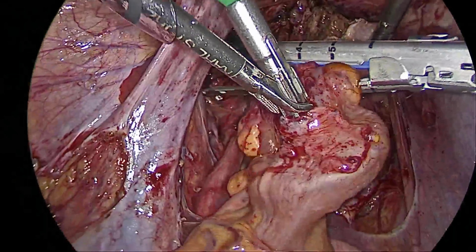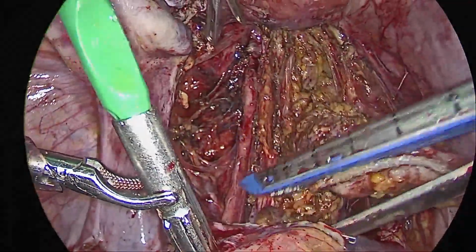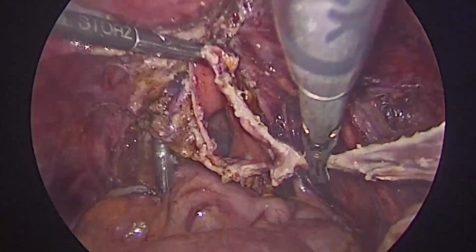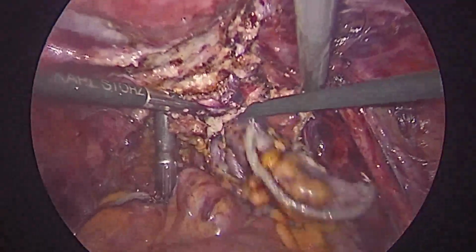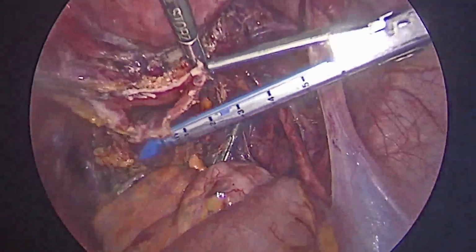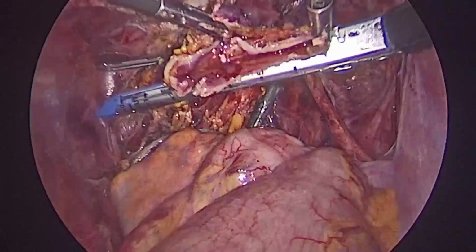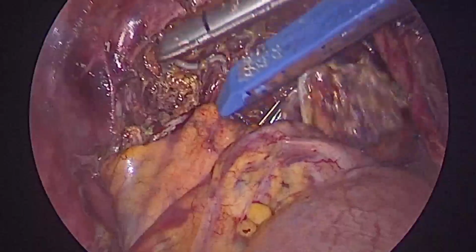The diseased segment of bowel is divided from the proximal colon using a linear stapler. The segment is then divided from the distal colon sharply, and the specimen is removed through the rectum. The distal healthy colon is closed with a linear stapler, and the small segment of diseased bowel is removed through a laparoscopic trocar.